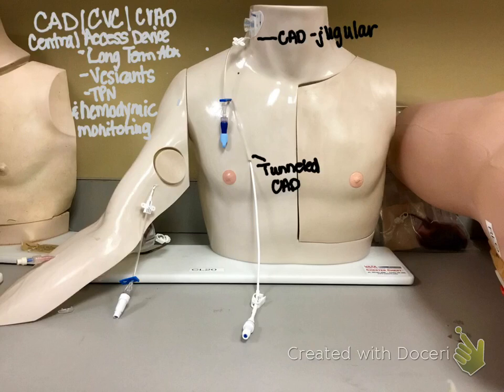So let's see what our next one is. So tunneled. I'm going to talk a little bit more about the tunnel, but this is just the tunneled. Often you will see 1 lumen, sometimes 2. And the tunnel catheters always have these clamps, and I would say just clamp it. The tunnels are a little different than the others. It's there for long term. You may have someone that is dialysis or cancer, or for chemo, or even rheumatoid arthritis. Anybody with long-term needs may have a tunnel catheter.